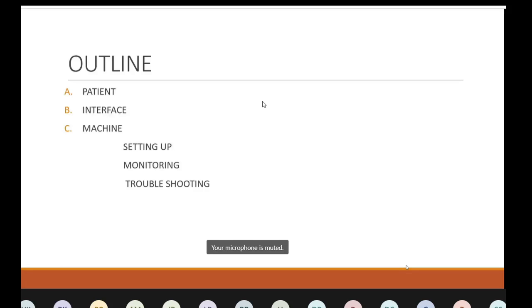So just a word about ABG. It has not been mentioned till now. If you are perplexed about ABG, just a word about PF ratios. Normal partial pressure of oxygen in the blood is 75 to 100, and you get a partial pressure of around 80 at an atmospheric FiO2 of 20. So when we are breathing at 21% FiO2, the PaO2 is 80, so the PF ratio is more than 400. A normal PF ratio is 400 to 500.